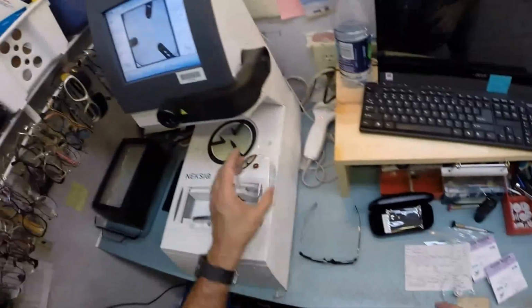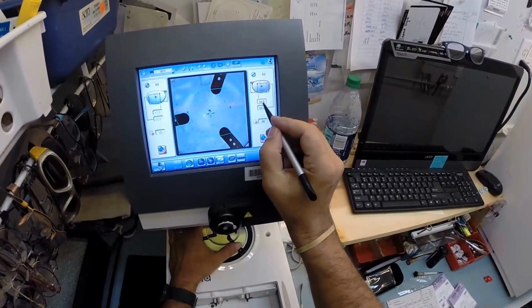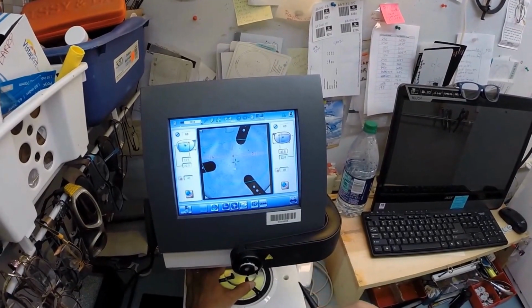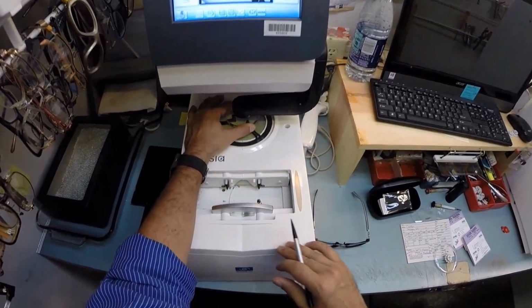Let's do the same thing now for the left lens. Pull the paper away to make the black side sticky. Line up the magnet so it stays in place. Now your left eye is mirrored to your right. Your 33.5 is your pupillary distance there. So we're going to put the optical center right there. Hit the button and then the arm's going to come down. Come on, arm. Come on down. It's going to come down and place the block onto the left lens.